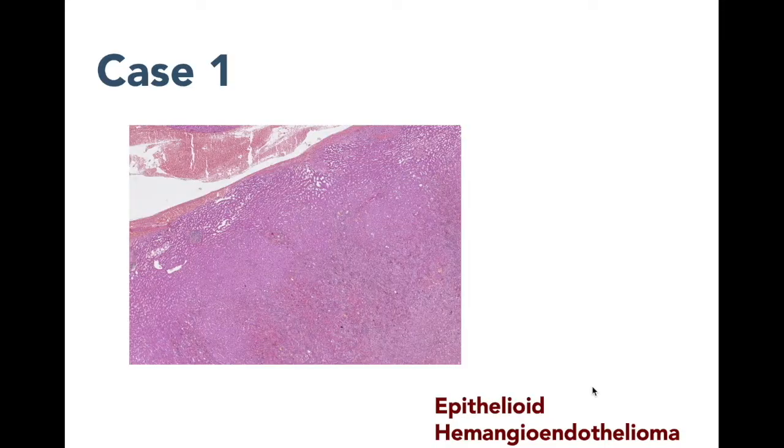And we'll jump now to the conclusion. So this case was an epithelioid hemangioendothelioma. Some learning points: these tumors may be multiple. You have this fibrosis at the center. It's not always there, but it's a good clue for the diagnosis. You have these large neoplastic cells that look like epithelial cells, and it's important to search for intracellular vascular differentiation with these vacuoles and red blood cells.